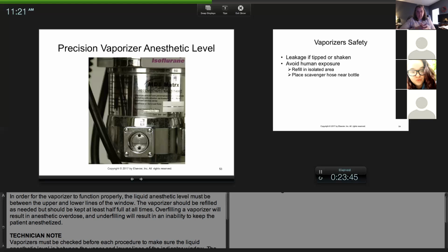Ideally, you want to leave the room, because I've had people who've spilled anesthetic or been exposed and start to get dizzy and woozy. You will get exposed to this and you can get sleepy. If you have a spill, ideally you are supposed to ventilate the area. Like I said, if you spill it, you can go get a towel and paper towels, but I'm going to bet you by the time you get back, it's almost going to be gone because it's going to vaporize.